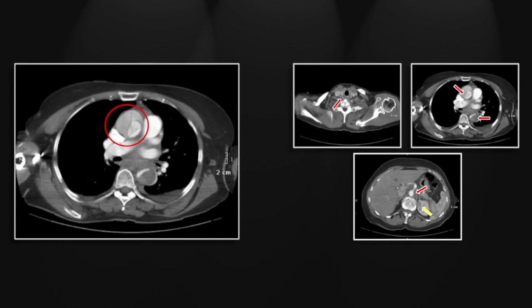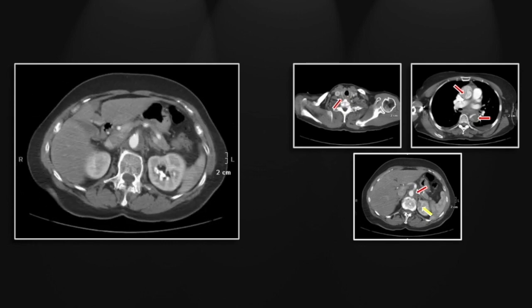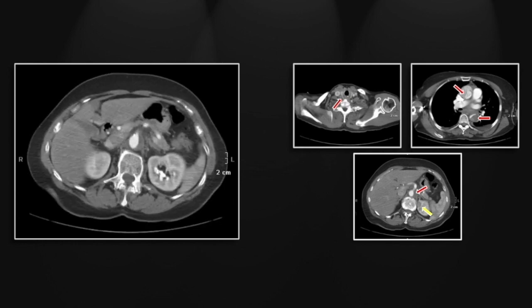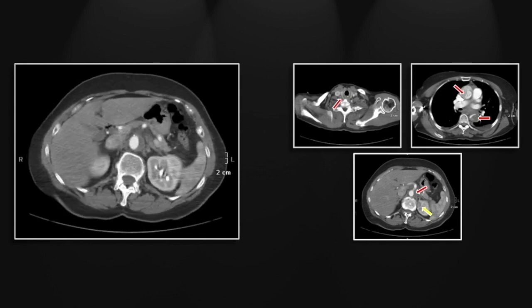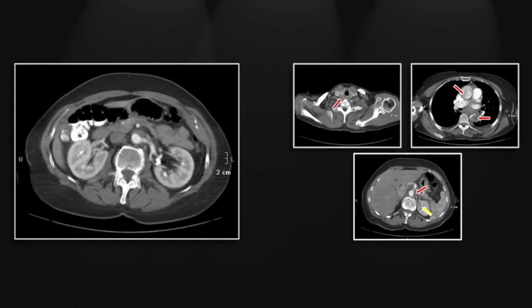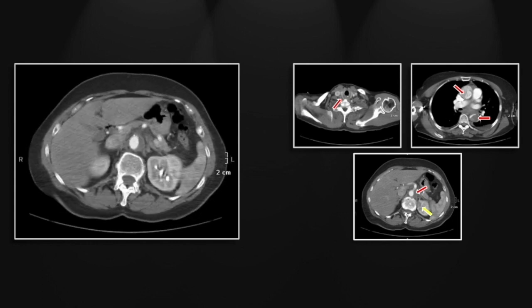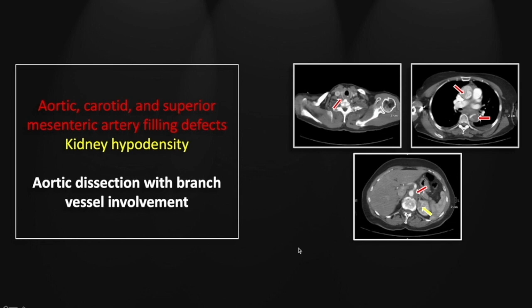There is the carotid involvement, the ascending aortic and descending aortic involvement. Now watching for branch vessel involvement: first the celiac just at its base, next the superior mesenteric origin involvement which is indisputable. Look at the left renal artery — wrapping around its base is that dissection. The cortical defect is the telltale sign of left renal artery involvement. So this is another case of aortic dissection with extensive branch vessel involvement.